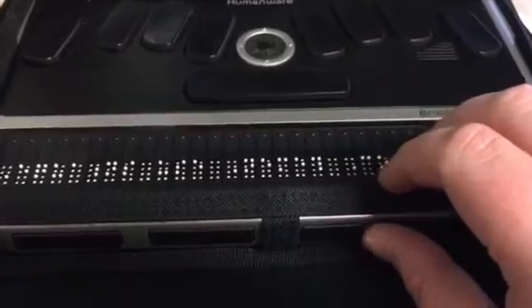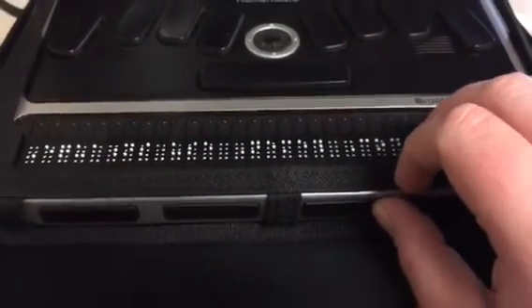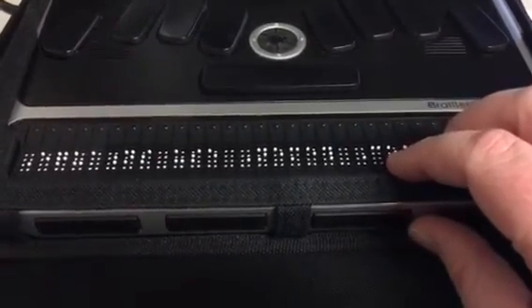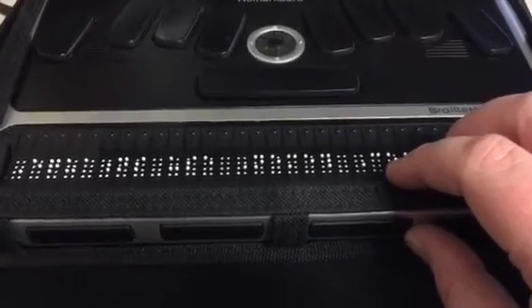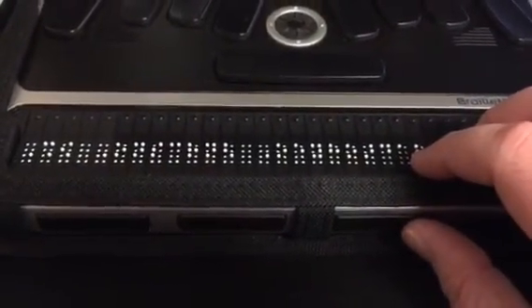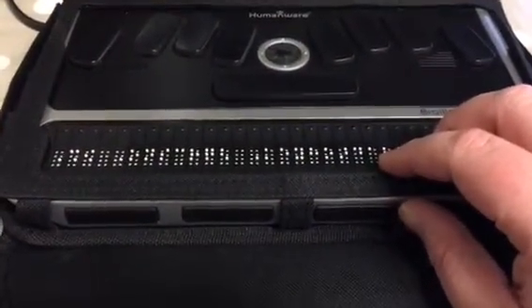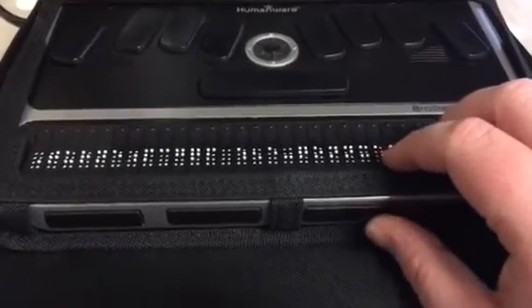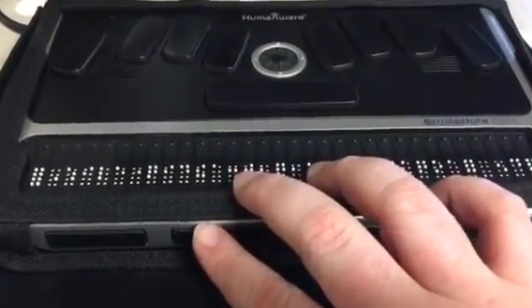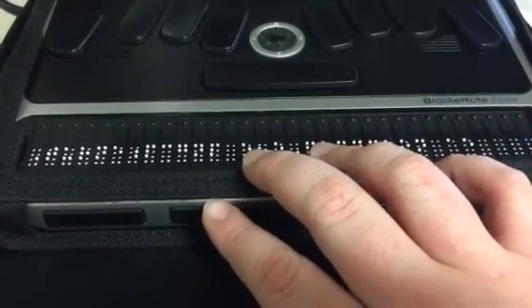You can also, instead of using the screen, press any of the keys on your Apex and it'll move throughout the screen, selecting different options if you want. I'm using the front buttons on the Apex that are below the Braille display. That's moving the focus either up or down on the iPad.